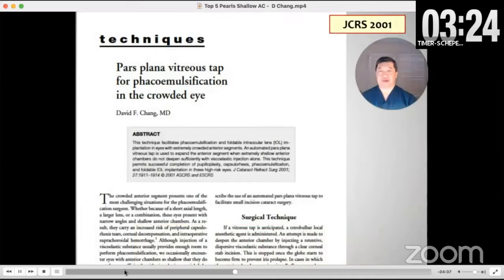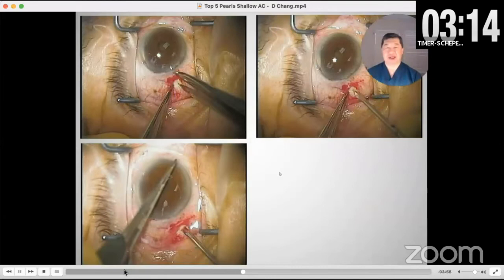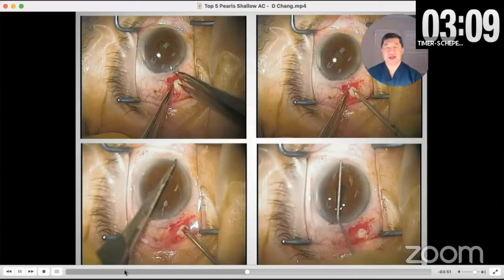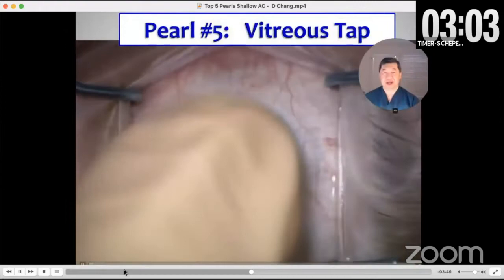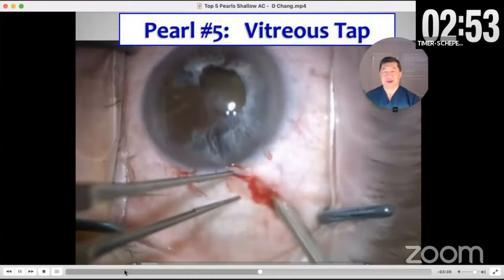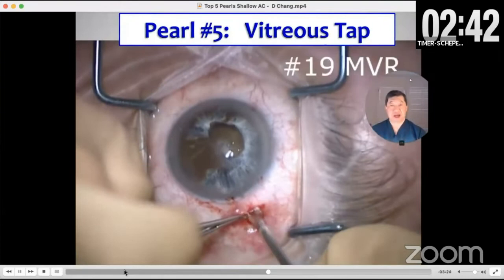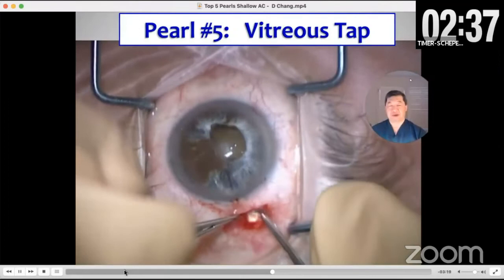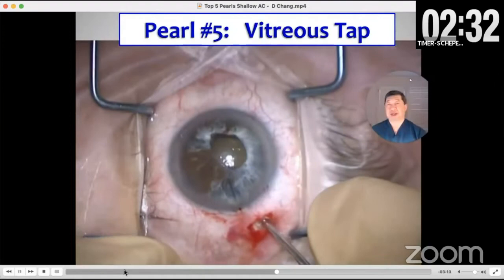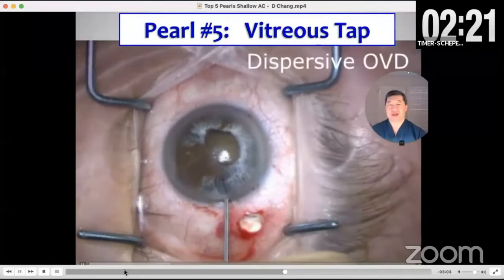This is a paper I published in 2001 with four cases of extremely shallow anterior chambers where I did a vitreous tap — going three millimeters behind the limbus with the MVR blade, then using a vitrector without infusion to just soften the eye. You take a little bit out and that lets you deepen the chamber. Here's a case with a very dense lens and an extremely shallow chamber. I'm in the oblique quadrant, three millimeters behind the limbus. I take the MVR blade and aim posteriorly toward the optic nerve so there's no chance of hitting the lens. I remove just a little bit — perhaps 0.2 mLs.